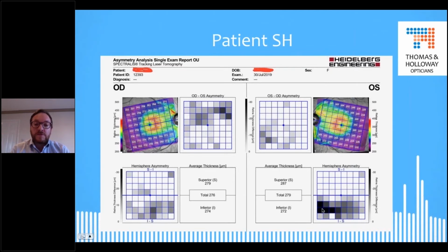So this is saying that in this area that's dark here, the retina is measuring quite a bit thinner than in the mirrored part just up there. Now, from seeing this first hand, but even on these scans, there are no significant blood vessels that would be causing an artifactual error just there. Okay.